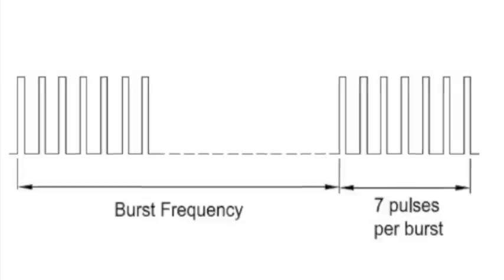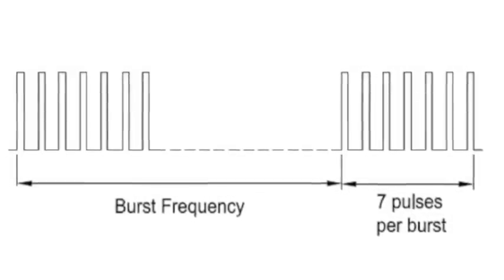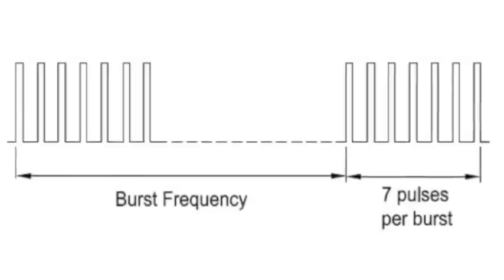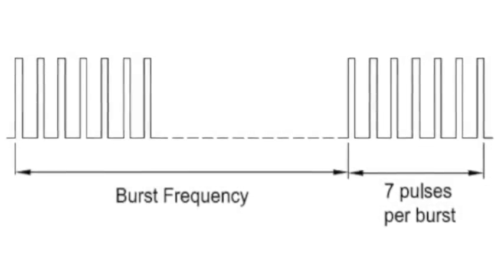In the burst mode, the impulses are going to come up and down, and then they're going to go flat, so there'll be no impulse, and then that will repeat on and on for the duration of the treatment. When we're in the normal mode, basically what happens is you just get impulses throughout the treatment.